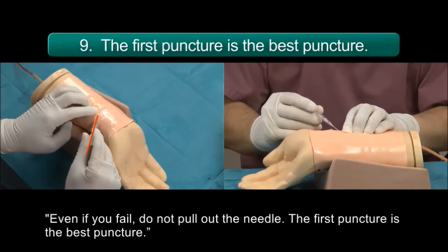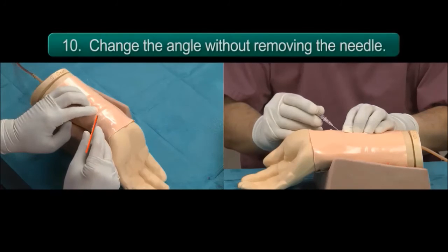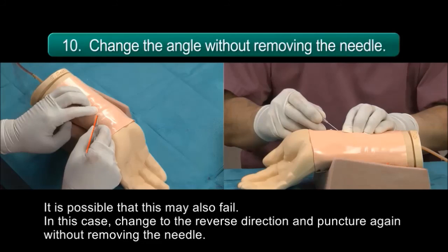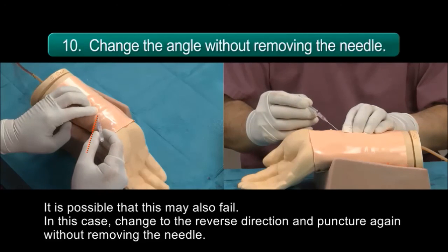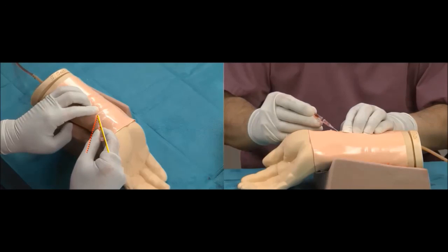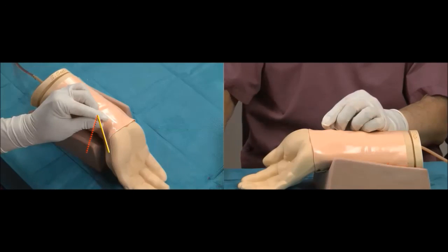Even if you fail, do not pull out the needle. The first puncture is the best puncture. Without pulling out the needle, change the angle and puncture again. It is possible that this may also fail. In this case, change to the reverse direction and puncture again without removing the needle.